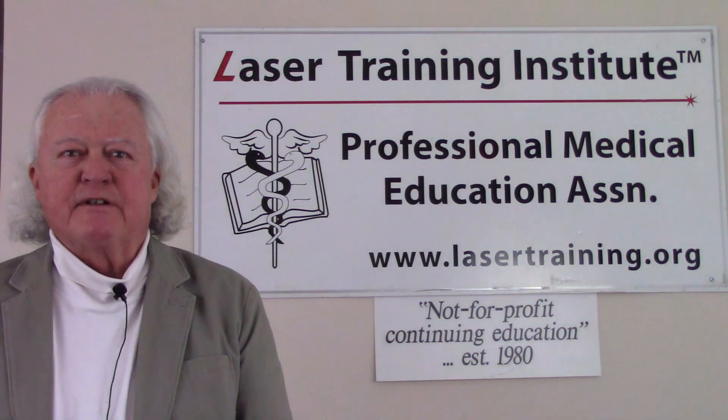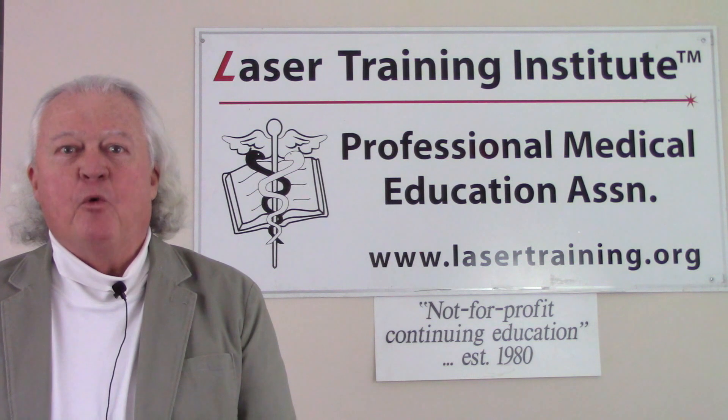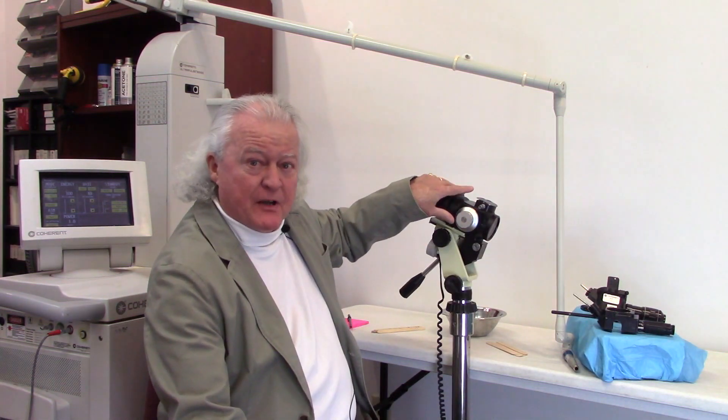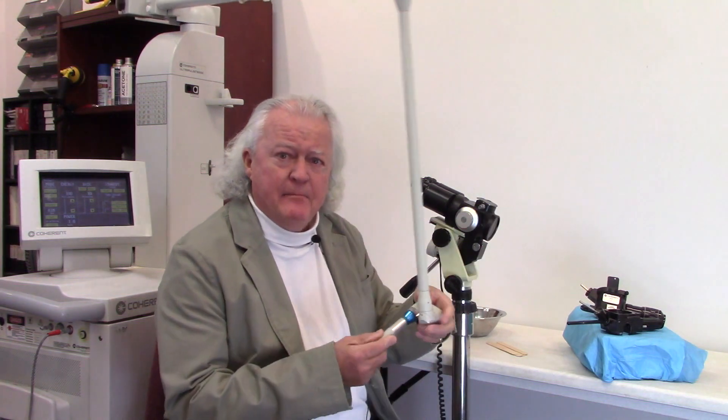Hi, this is Greg Abston from the Laser Training Institute of Professional Medical Education Association. Welcome to our short video series on medical laser training. In this laser lab video, we're going to see how to adjust the spot size of the laser through a micro manipulator on a microscope. We'll have a separate video on how to use the handpiece with a freehand CO2 laser to control your spot size so that your power density is just right for vaporizing at any power you set.